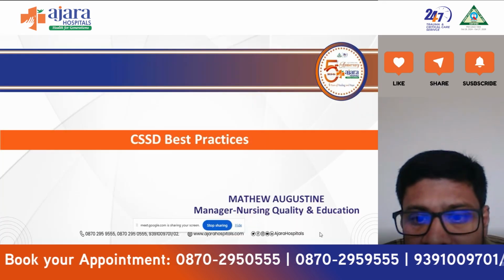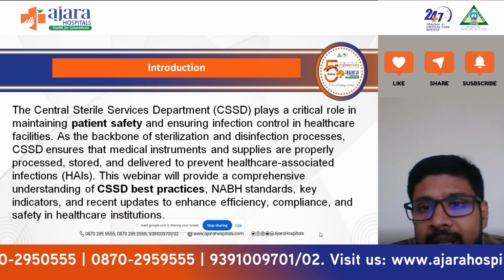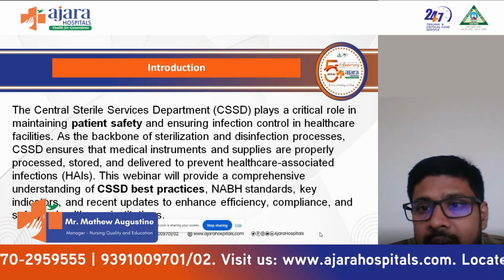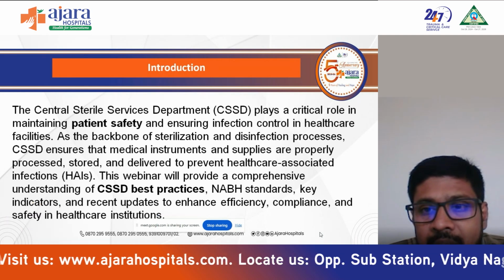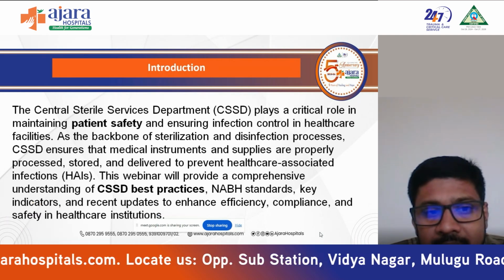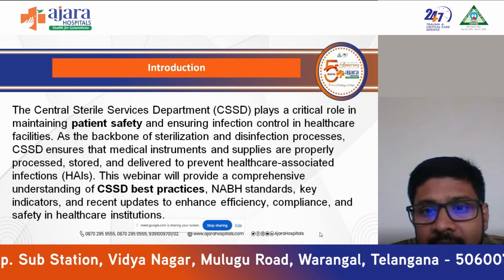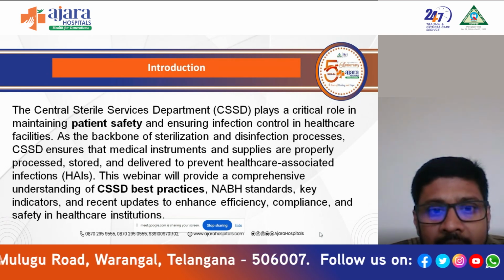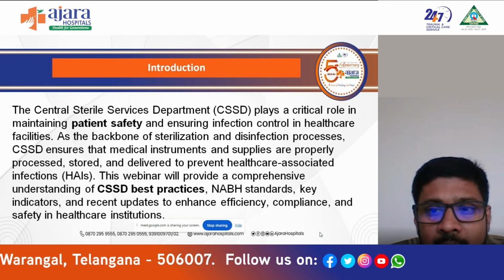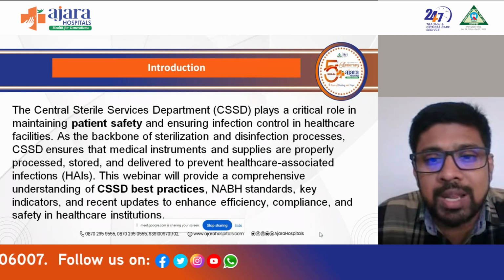Let's begin with the CSSD best practices. First, what is the Central Sterile Service Department? That is CSSD. It plays a crucial role in maintaining patient safety and ensuring infection control in healthcare facilities. This is the backbone of the hospital because the CSSD provides the sterile instruments for the hospital. It maintains the quality of the hospital and it prevents hospital acquired infection.